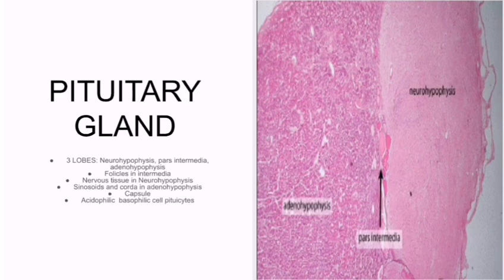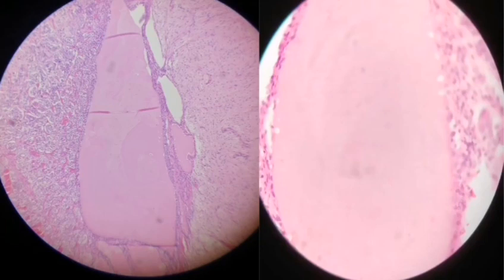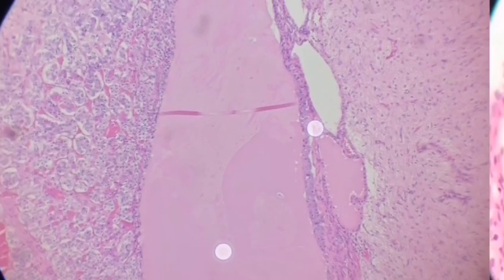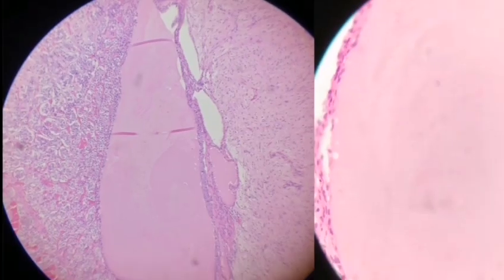And now we are going ahead to some other pictures. So this is a picture of the follicle that I took at the lab. It represents the pars intermedia, right? And this is the lining of this follicle. And in this exam, you might have this type of fixation of the slide. So you can see the three lobes there, and then mark the answer as pituitary gland, right?